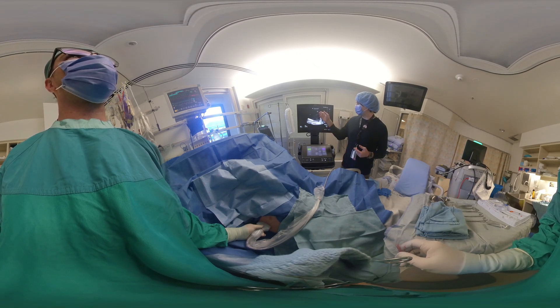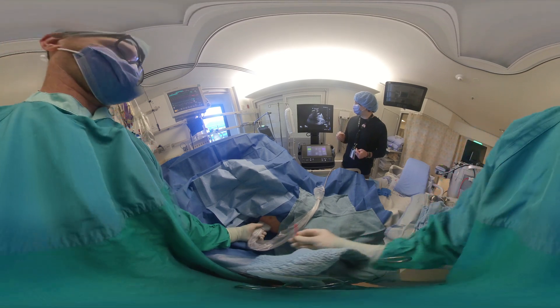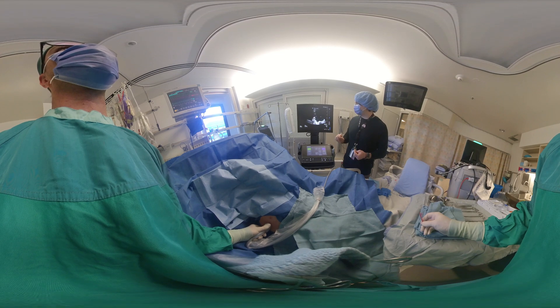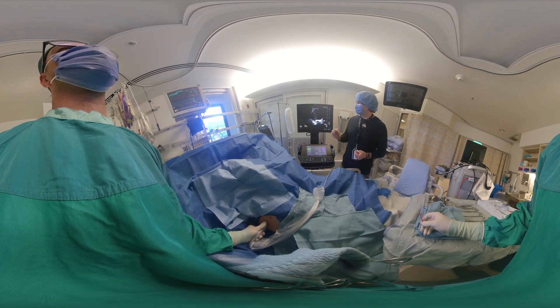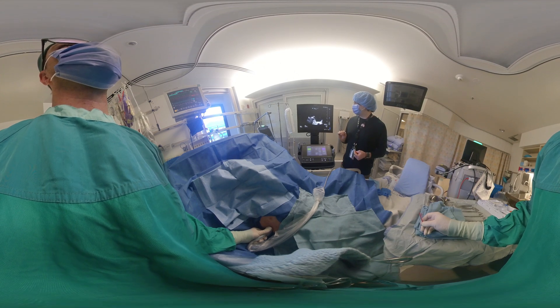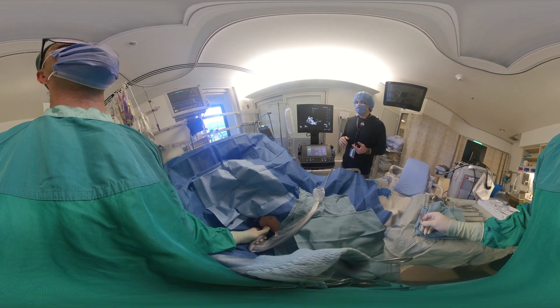Now we're going to try this in two planes. Move the probe 90 degrees counterclockwise — you can see a very large area in cross-section, a nice safe space to enter, away from lung by more than three centimeters. Now that we've marked it in two orthogonal planes, we're going to use a blunt-tipped cannula to make a mark on the skin to guide the thoracentesis.